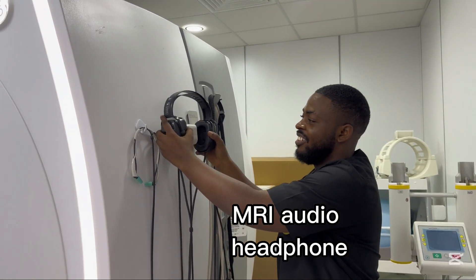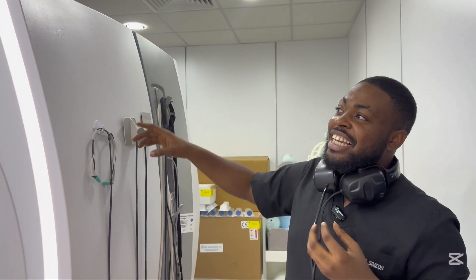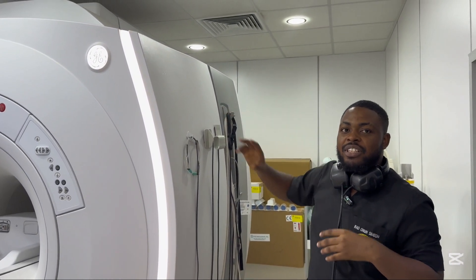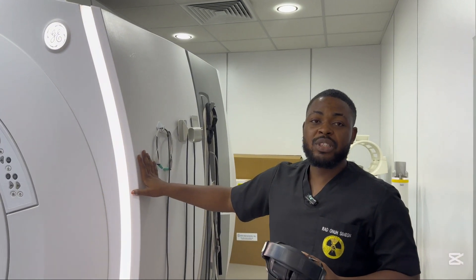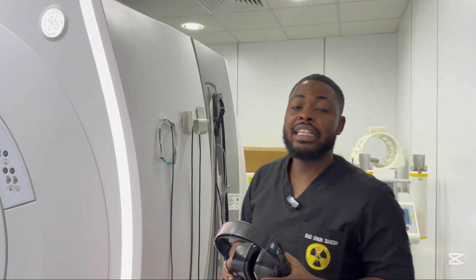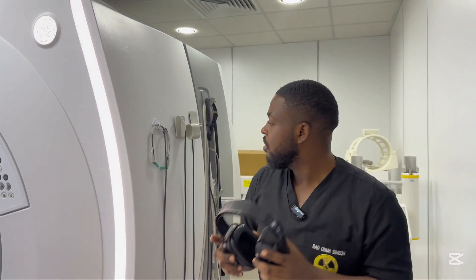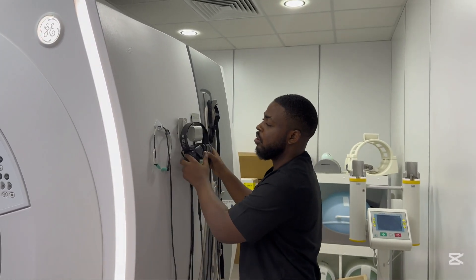This one is headphones — very cool if you want to listen to music. The machine makes a lot of noise, you can hear it making noise in the background. Once we start the coils and other things inside, it makes very high sound and it's very deafening to the ear. So we use these to protect the ears. If we're using coils that prevent using this, we use the smaller one.